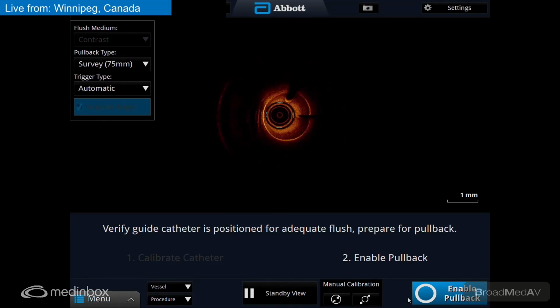You know what's happening is there's quite a bit of tortuosity. Hold the wire there for me again, Arjun. There we go. That's with the armor sheath. Yeah, it's really hugging the guide as it's going up. There's a couple of S bends down in the iliac.